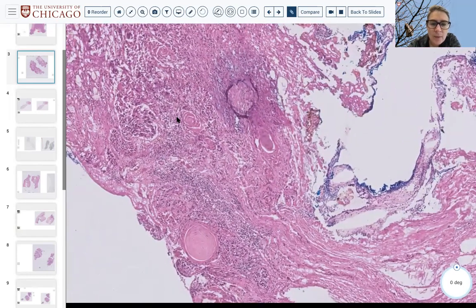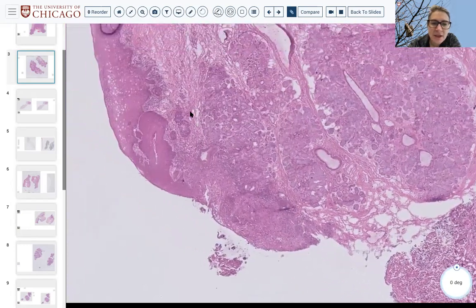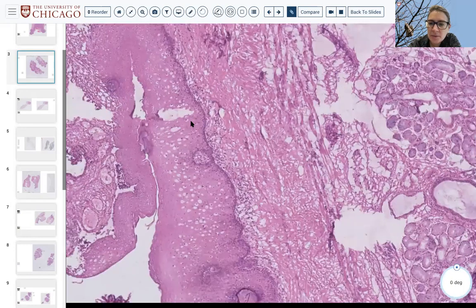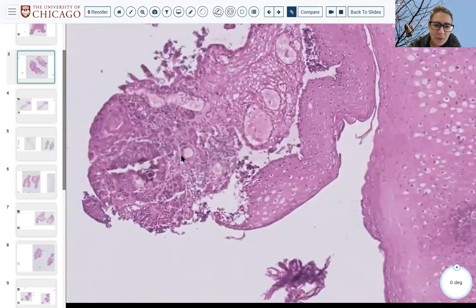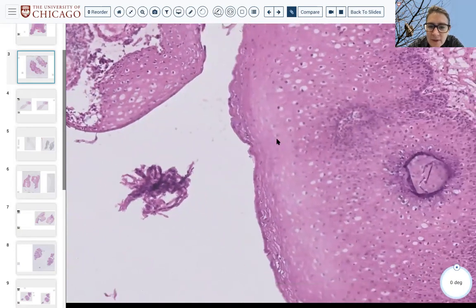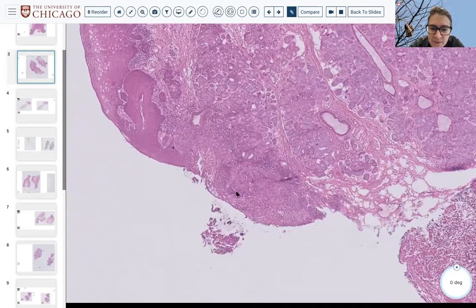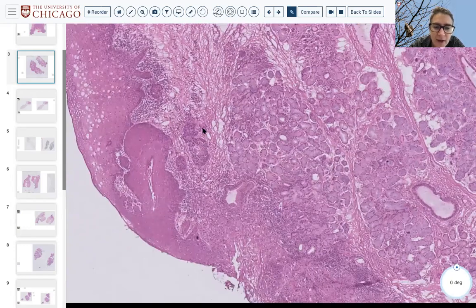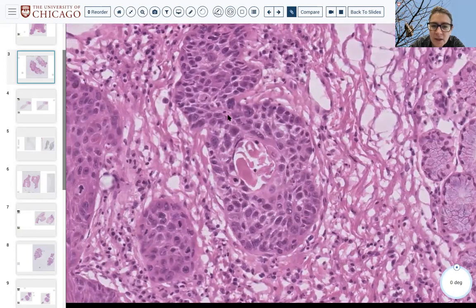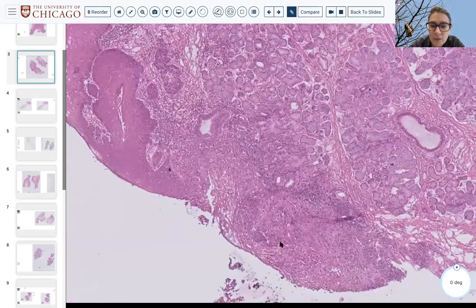Exactly. So remember that in any mucosal specimen, it doesn't have to smack you across the face. Like this is completely normal in most of it. And then, oh wait, whoops, what's this? There's a little bit of piling up of the tissue from the frozen, maybe a little 3-dimensionality. And then like you guys were saying, there are tiny foci suspicious for tumor. There it is. So perhaps this little island here with increased mitoses, with some keratin pearling, with some nuclear hyperchromasia and nuclear wrinkling. So these foci are not what you want to see on frozen.